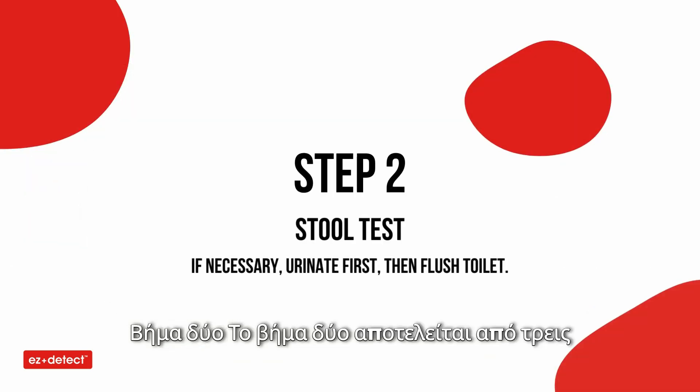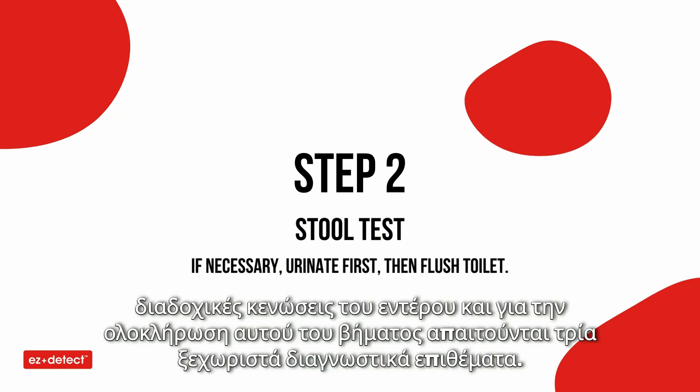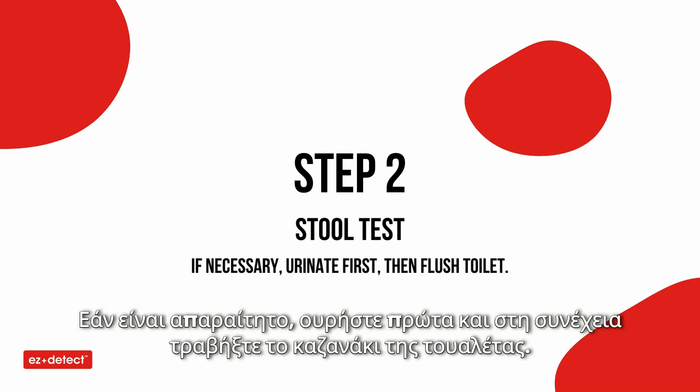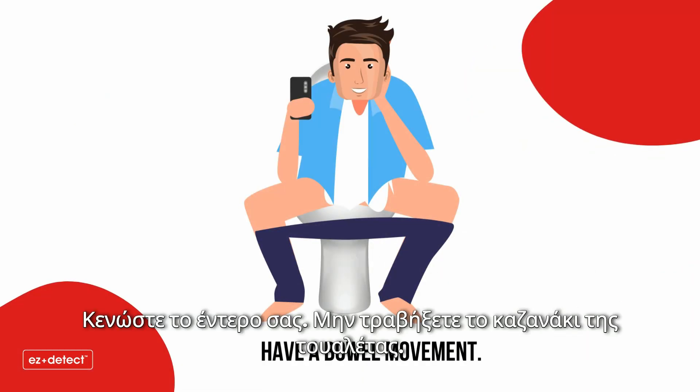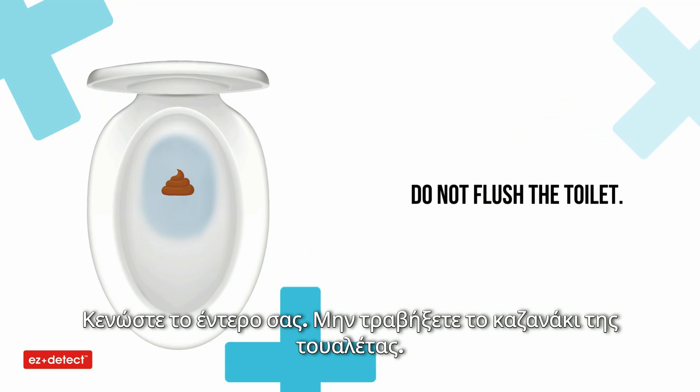Step two consists of three consecutive bowel movements, and three separate test pads are needed to complete this step. If necessary, urinate first, then flush the toilet. Have a bowel movement. Do not flush the toilet.